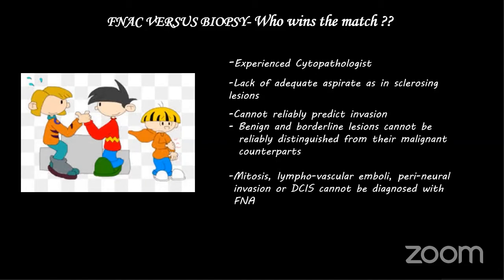Why? Because FNACs often give false negative results also, and there is a lack of adequate aspirate from the lesions which are sclerosing, or even from malignancies which are very hard. And we have seen reports from pathologists where it is written hemodiluted smear or lack of adequate aspirate, and then after that we again have to go for biopsy.